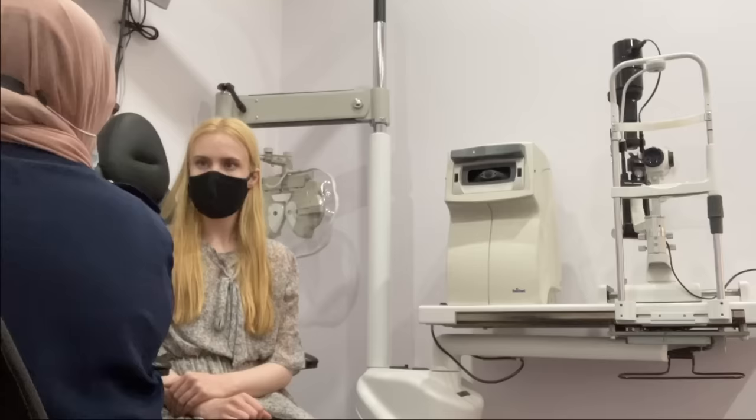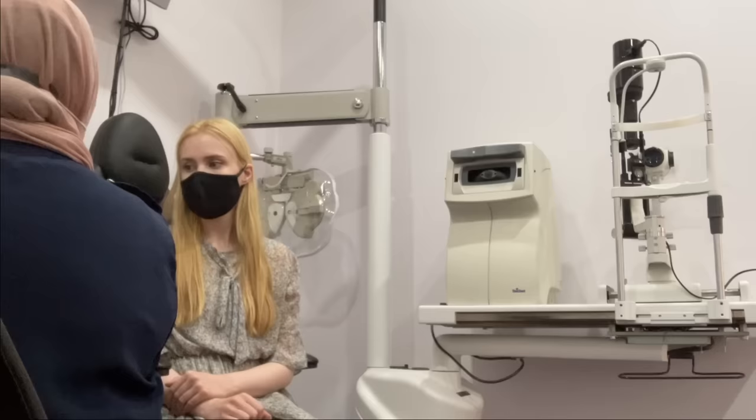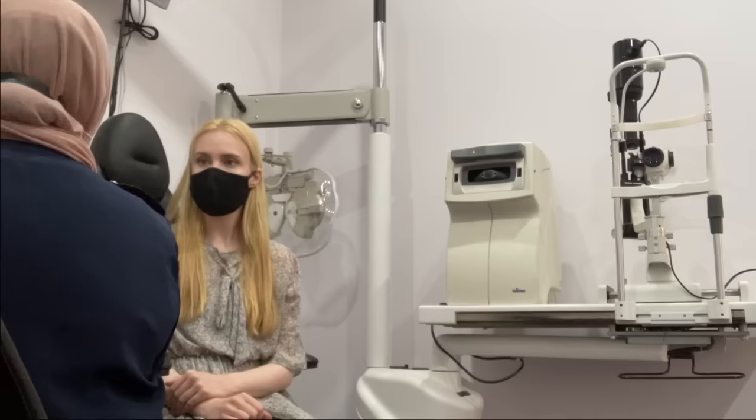The other option, as I mentioned to you, are almost like digital glasses. The company that we deal with is a particular lens manufacturer that deals with digital lenses, where your distance is as normal, but as you start to look closer, towards the computer and towards reading, there's a soft focus that they put into the lens, which just helps you focus at your digital devices more comfortably. So that's another option for you, should you wish to do that.